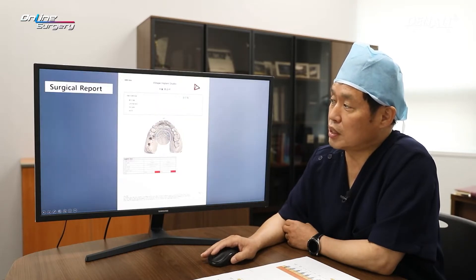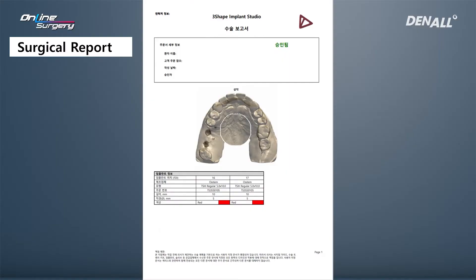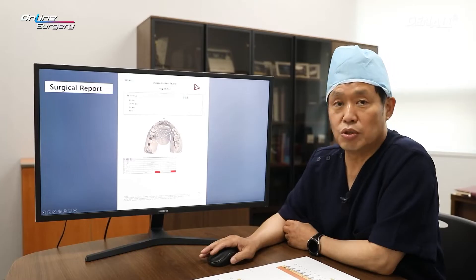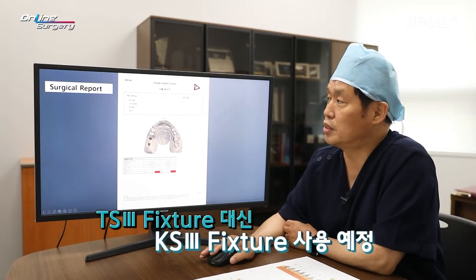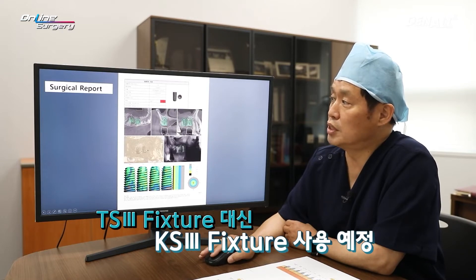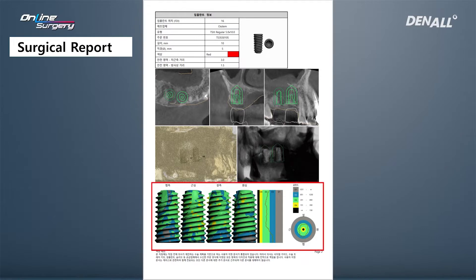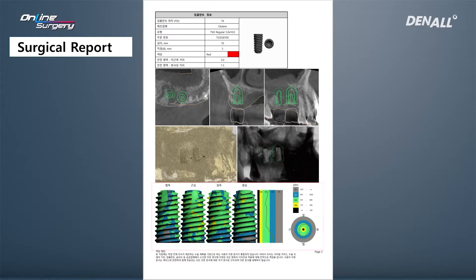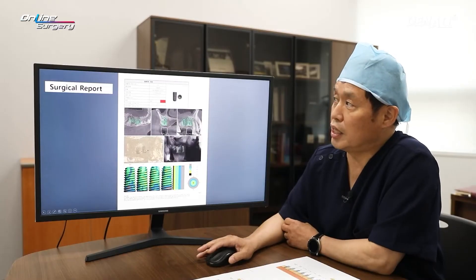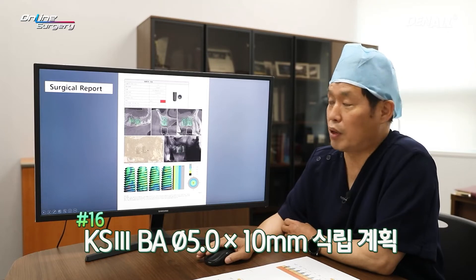In the surgical report, one cast was decided to be used for number 16 and 17. TS3 was recommended, however I decided to use a KS3 implant. In number 16, residual alveolar bone is 10 mm and is sufficient. I'm guessing the bone will be slightly soft, like D2 to D3. A KS3 5.0 by 10 mm implant was planned.